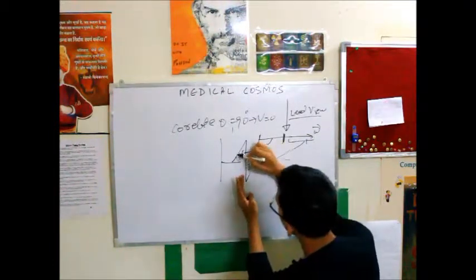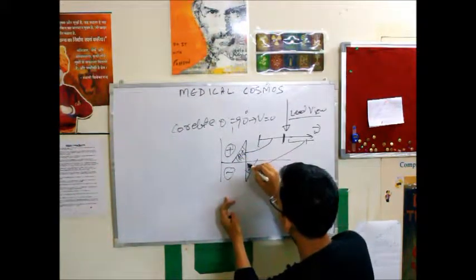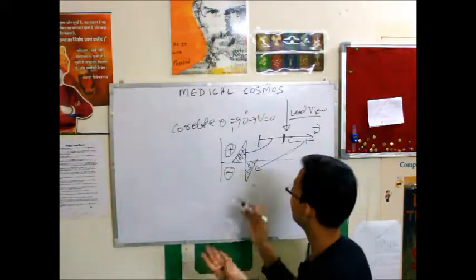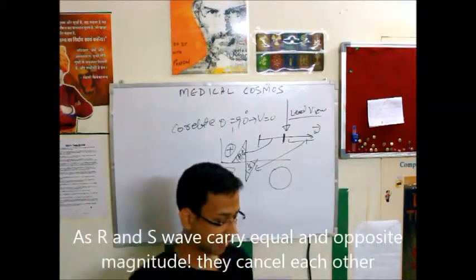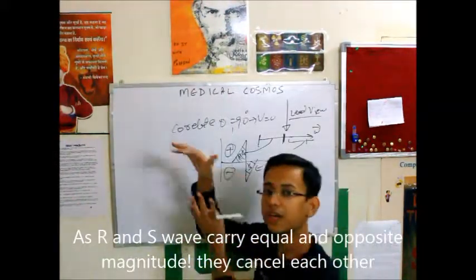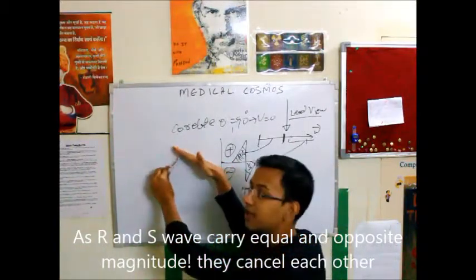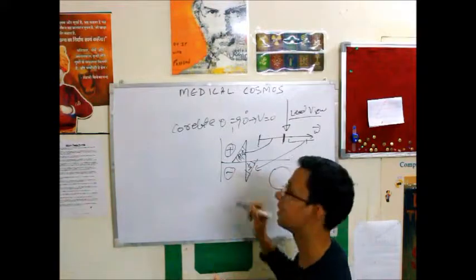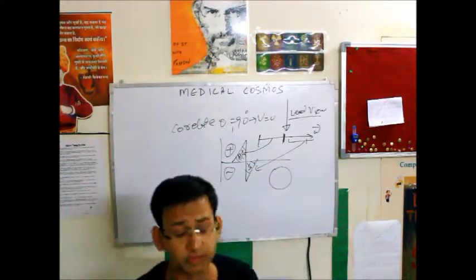In vectors, one is positive and one is negative. If we add them, we get net 0 potential of that vector. Exactly what we said: the shadow of the vector at 90 degrees would be 0, and exactly this is what we are getting. I hope you have achieved this concept very clearly.